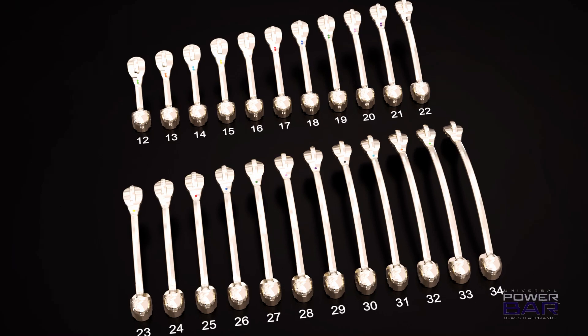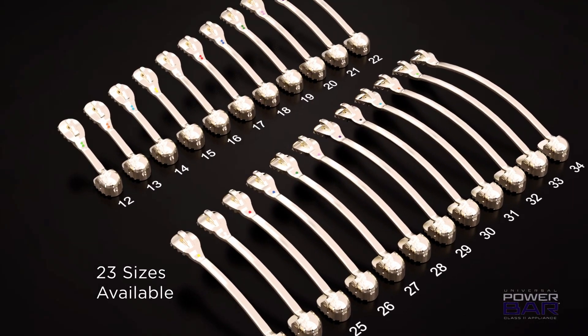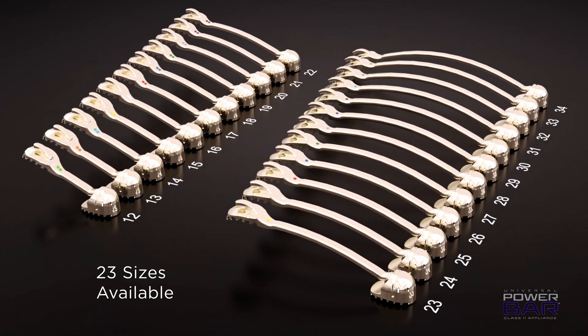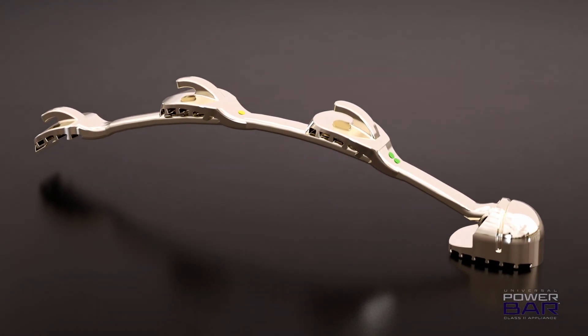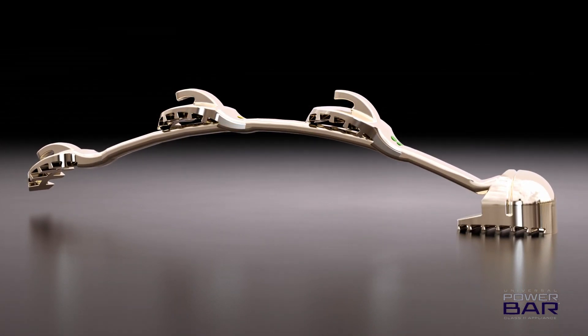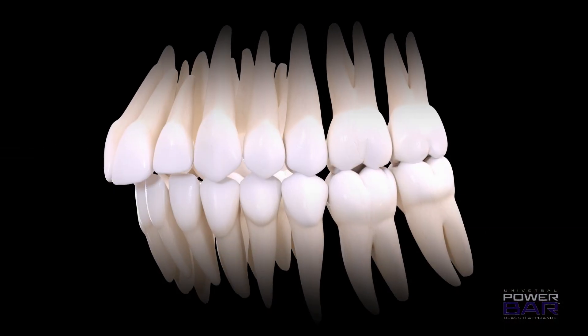The Universal Power Bar comes in 23 sizes, all individually identified by color. Having this wide array of sizes provides the orthodontist with the flexibility of spanning the Power Bar from cuspid to molar or premolar to molar in patients of all ages and growth levels. Being universal, doctors can feel more comfortable incorporating different sizes between right and left, knowing the remaining arms can be used in future cases.